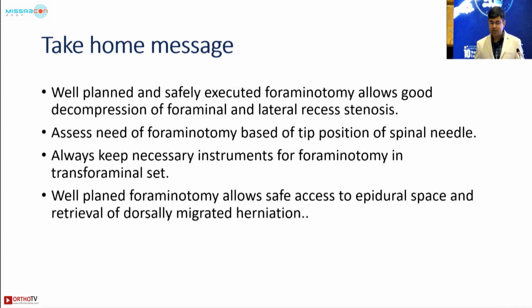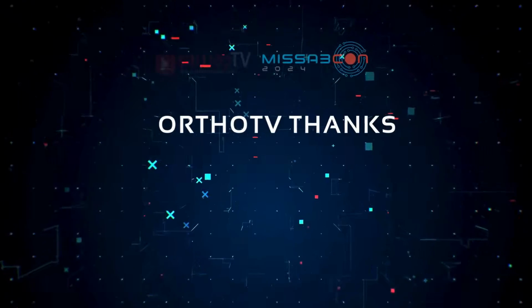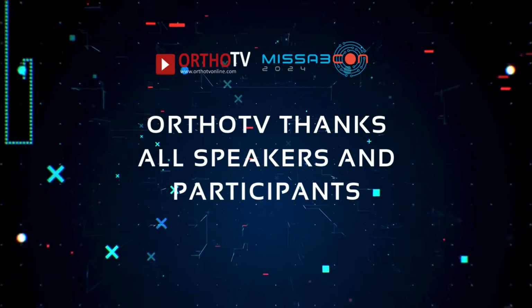So this is my take-home message to you. A well-planned and safely executed foraminotomy allows good decompression of foraminal and lateral recess stenosis. Assess the need for foraminotomy based on the tip position of the spinal needle. Always keep the necessary instruments for foraminotomy in a transforaminal set. A well-planned foraminotomy allows safe access to the epidural space and retrieval of the dorsally migrated disc herniated fragment. Thank you.